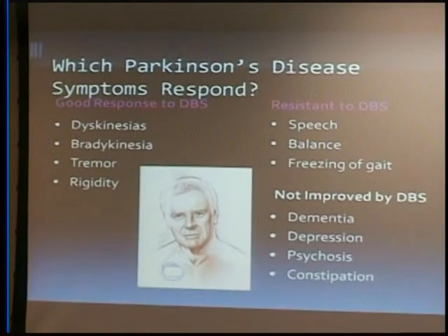Certainly, as someone has had DBS longer and longer, and their Parkinson's has progressed years down the road, these are the issues that I'm dealing with in the clinic. I'm not dealing much with tremor, dyskinesia. Those things are all under really good control. But people are coming in talking about their walking and their balance being difficult. So it's a couple of symptoms that we're kind of battling, trying to get the best control that we can.